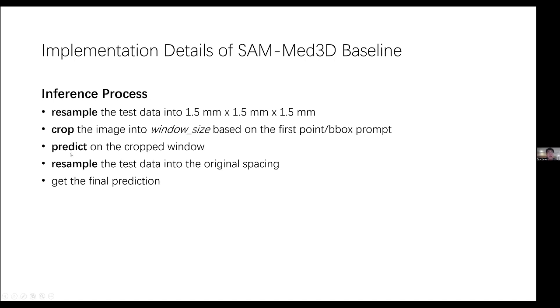Then we just predict the segment on the cropped window. Then we resample the prediction back into the original space and attach the prediction into the original position and get the final prediction.